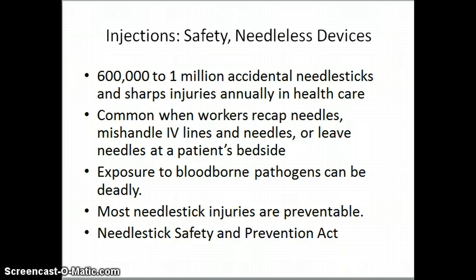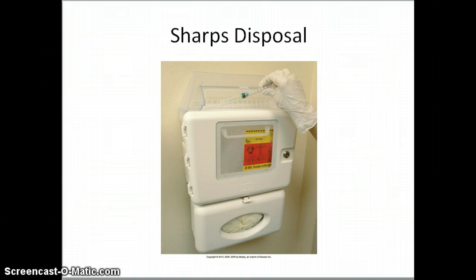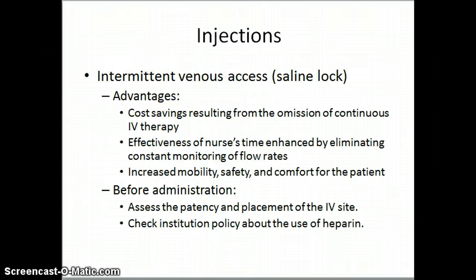If you have a needle stick injury, you will want to bleed the area. You will want to wash with hot soap and water, report it, and follow what your protocol is in that facility. This is the plastic needle then that comes, or the plastic guard that comes up over that. Here is our sharps disposal, and as we look at injections, we know that there are a lot of injections that have a lot of advantages, and we want to take advantage of that.